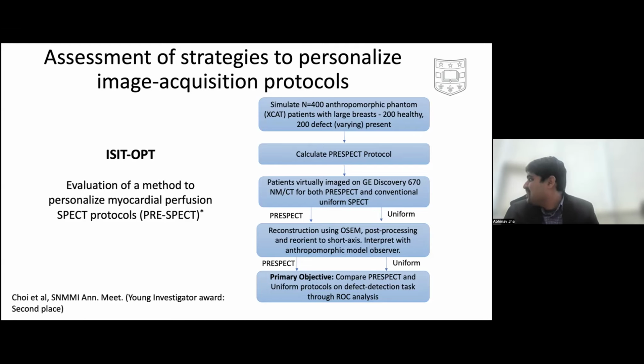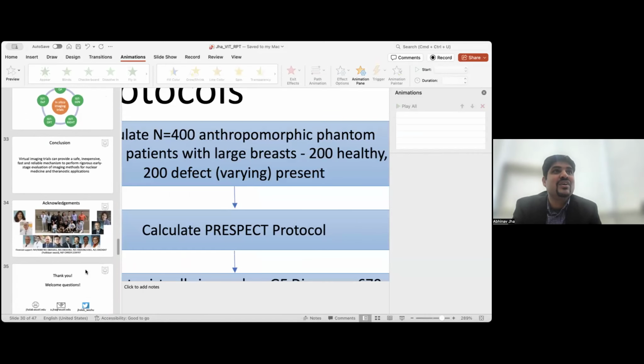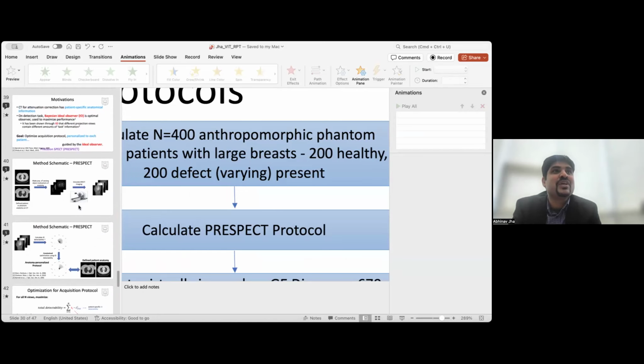Acquisition. So the duration of the scan or like what? The duration of the scan is the same. What you're trying to do is optimize the amount of time per view. Different projections have different timing, but at the end of the day, the total time is fixed.